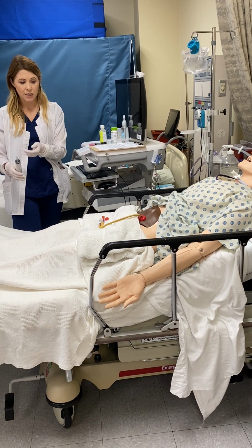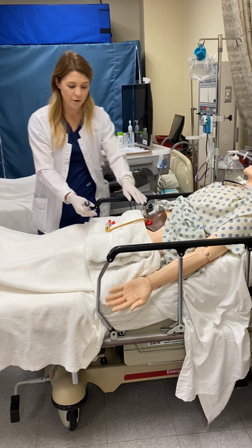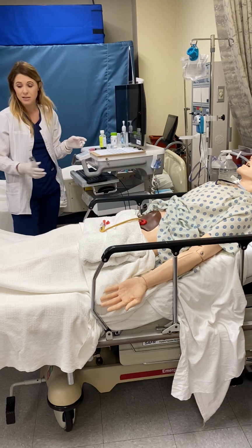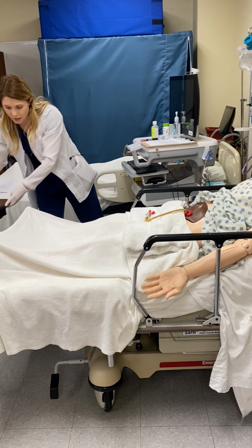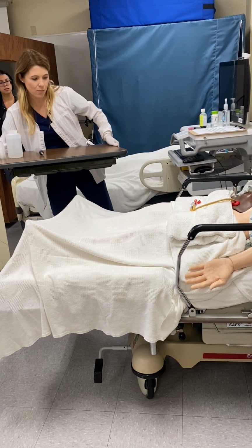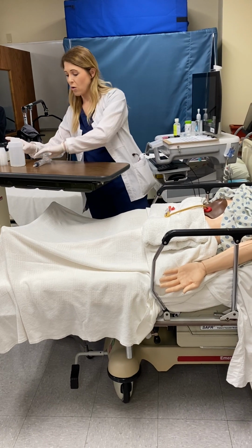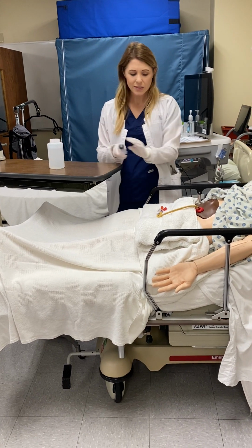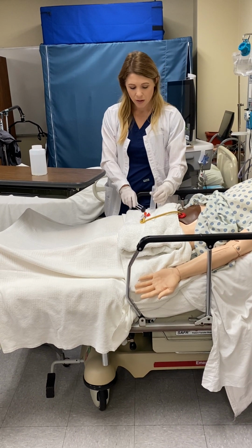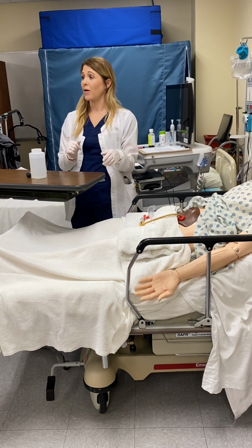Okay, so I got a 2 ml residual. The patient seems to be digesting fine. There's no issues with how far the tube's out. It's at a 19, which is what surgically they put it in as. And so now I'm ready to give you these medications, sir. So what I'm gonna first do is utilize this table to get closer to you. I'm gonna just keep pausing that, or I could just turn it off. This is when I now need to take the plunger out. Okay, so I've checked residual. I now do not need to use the plunger because we give feedings by gravity.